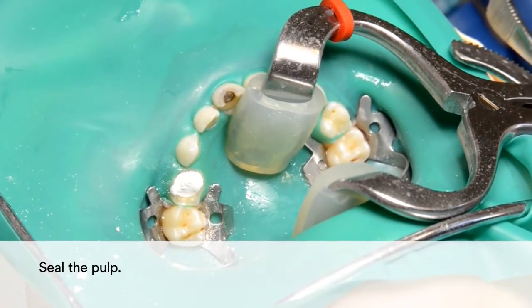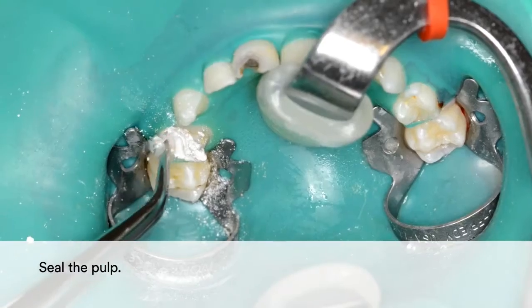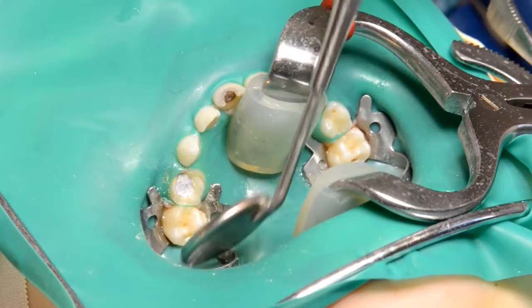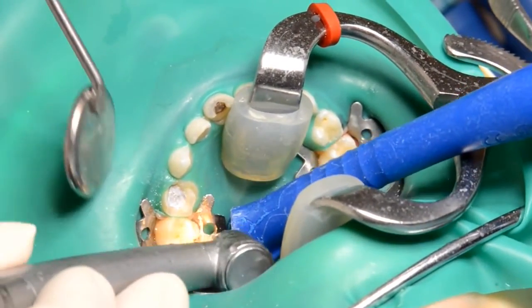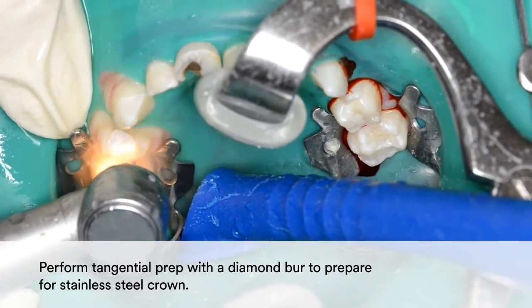Then seal the pulp. After sealing the pulp, perform tangential prep with a diamond burr to prepare for the Stainless Steel Crown.